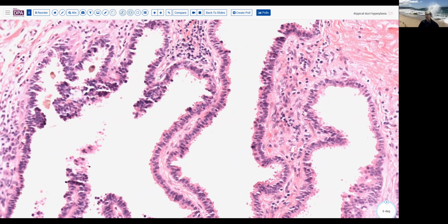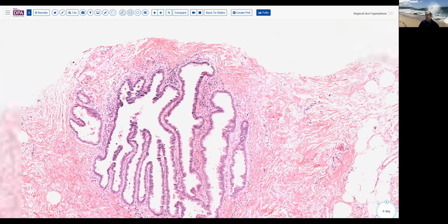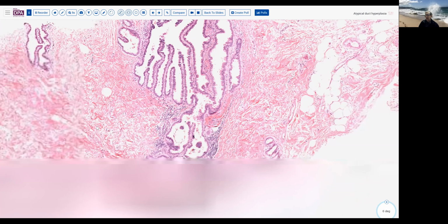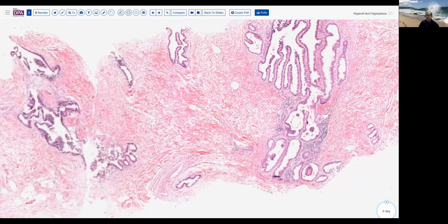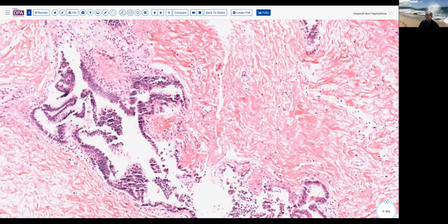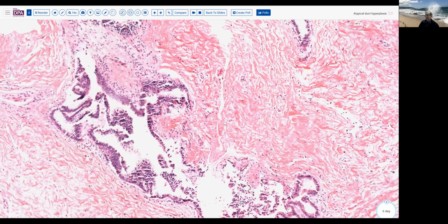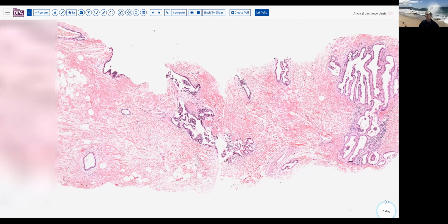So using the term atypical ductal hyperplasia is appropriate in this setting. And this is one way of communicating to the surgical colleague that this is a lesion that could be related to other changes elsewhere and therefore needs to be excised with a little bit more generous sampling than has been given to us on just this simple needle core sample.